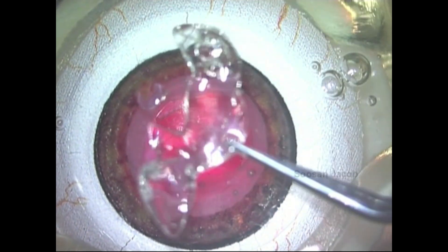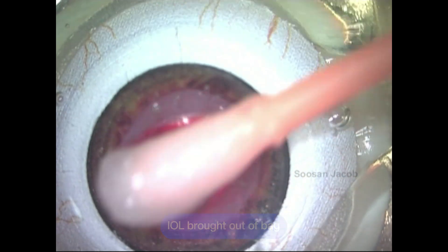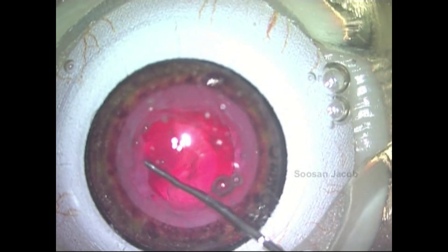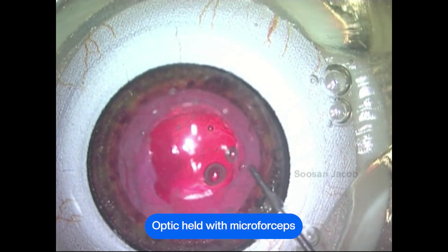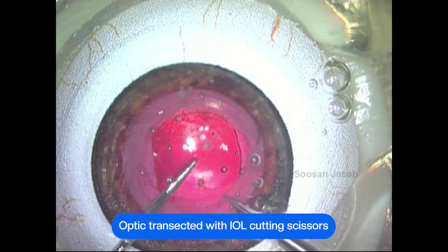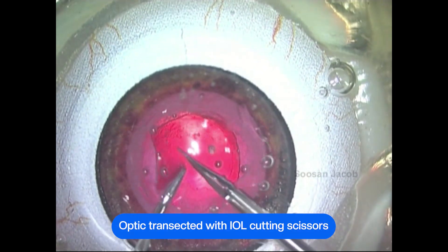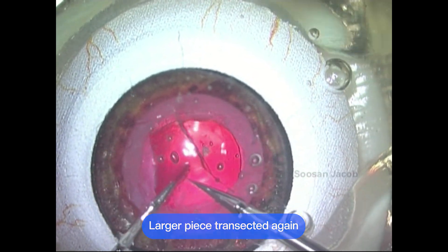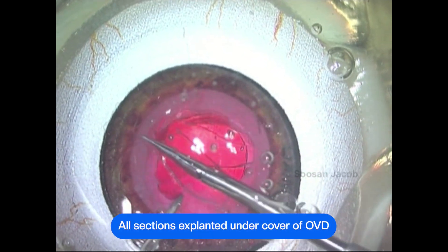The Vionico eye model provided me the perfect setting to be able to practice this safely outside the eye and do it a few number of times, so that when I am faced suddenly with this situation in the human eye, I am not unprepared. What simulators allow you to do is help you build your surgical skills in such a way that you are more prepared when you are actually in the surgical suite operating on your own patient.